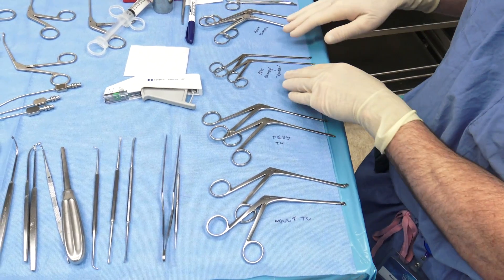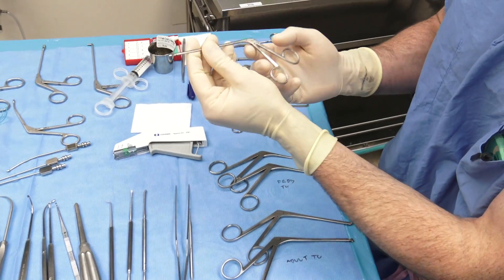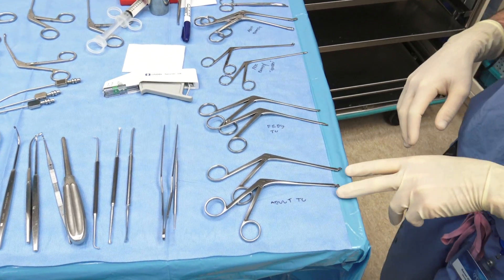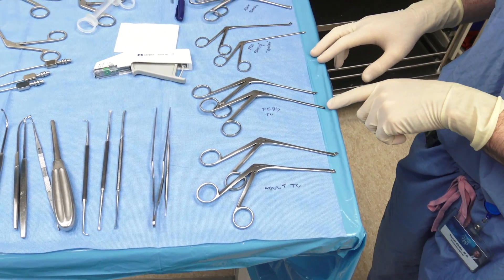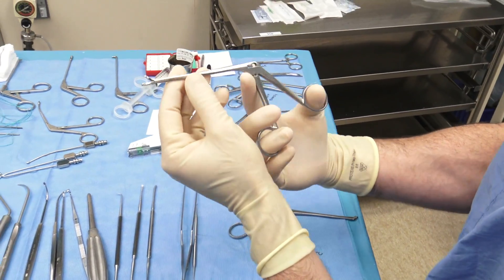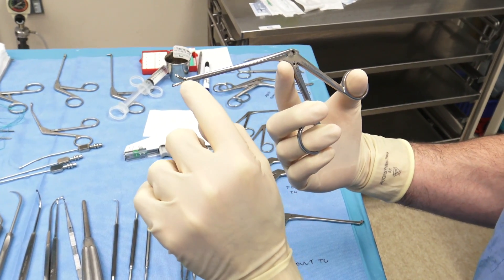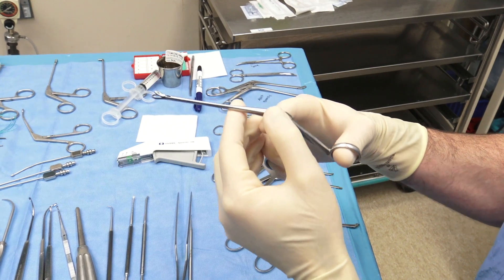I want to point out a few additional instruments. The Blakeslee graspers I showed earlier are not through-cutting instruments — they simply grasp tissue and remove it. However, when we're dissecting, we tend to use through-cutting instruments, which are mucosal-sparing. Here are our adult-sized and pediatric-sized through-cuts: straight adult, 45-degree adult, straight peds, and 45-degree peds. As I open and close them, they have a lip that goes into the lower tine and cuts through tissue. Note that if you bury the tissue all the way to the apex, that last bit doesn't cut very well — it cuts better toward the anterior portion when used intraoperatively.